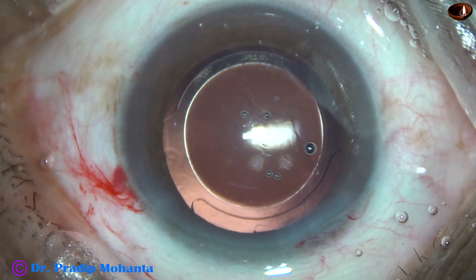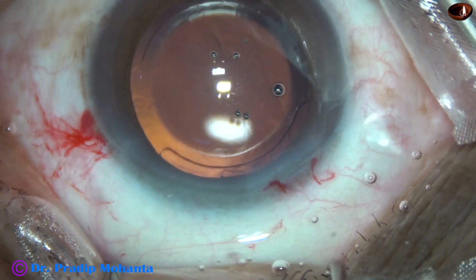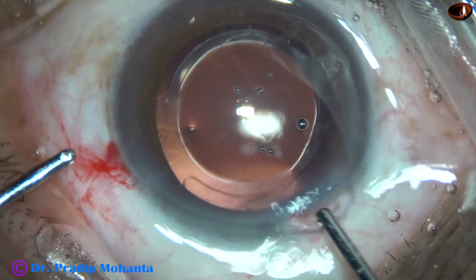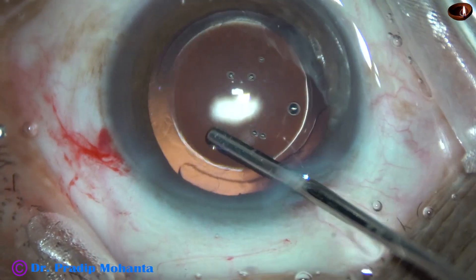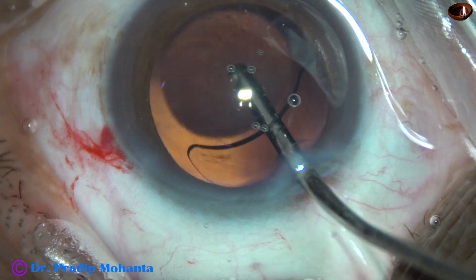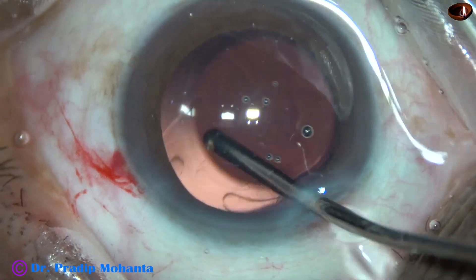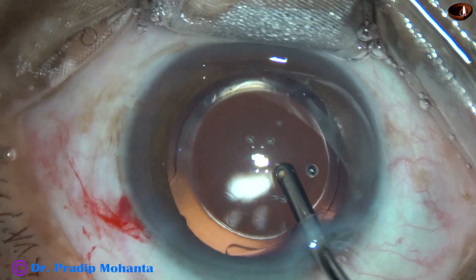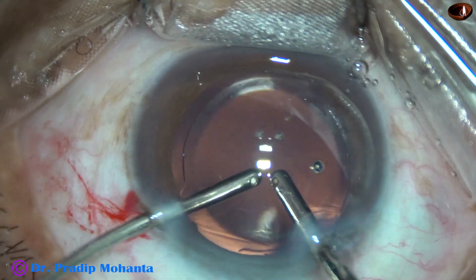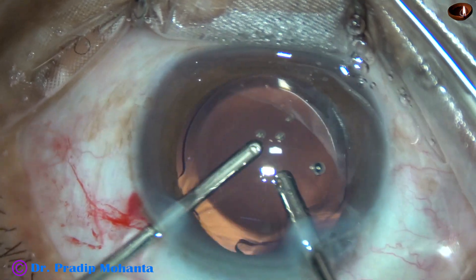We must give that much quality time to the patient. This is the irrigating probe of bimanual irrigation aspiration, being used to irrigate the anterior chamber and going behind the IOL to irrigate the capsular bag. A lot of visco molecules come out just by this irrigation. Then irrigation and aspiration are used together to remove some more visco molecules.